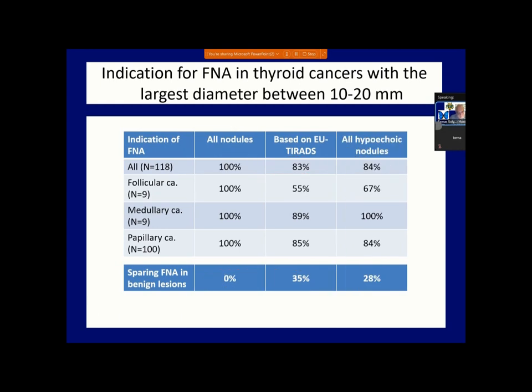There's a second problem, or a second layer of this issue, which leads us closer to today's topic. And this layer reveals a similarly disturbing and thought-provoking situation. Why spend time with the analysis and judgment of ultrasound characteristics other than echogenicity? Does it really have any advantages for the management of patients and for the interest of patients?